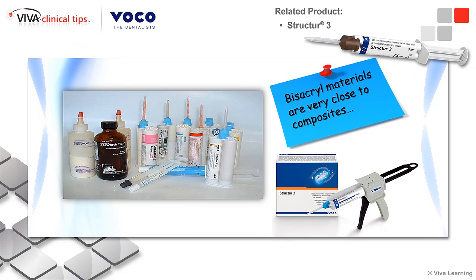We have now on the market a big number of materials available for this technique. Most importantly, keep in mind that we need chemical polymerization materials for this type of application. The resins used, for example, for temporary crowns and bridges are the best materials for this, and bisacryl materials are better than the traditional acrylic resins. Look here: traditional materials and bisacrylic materials. Not new generation, but more than these ones.